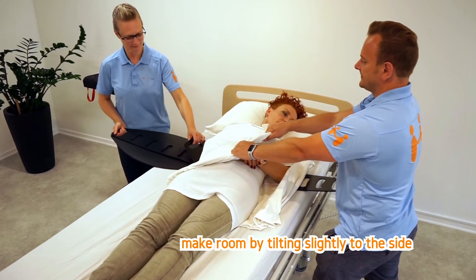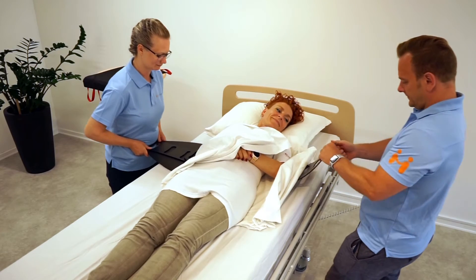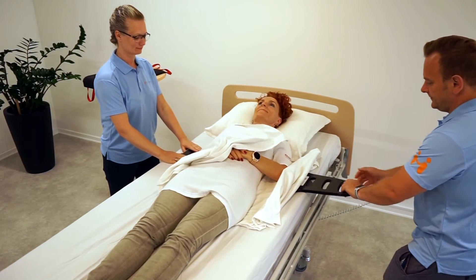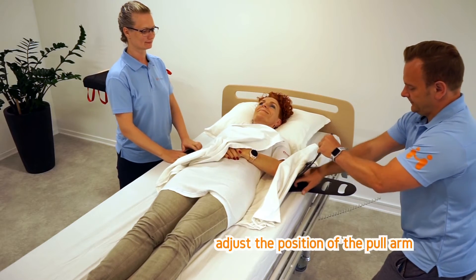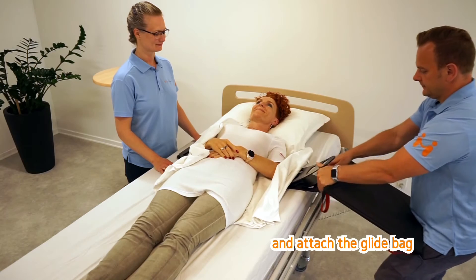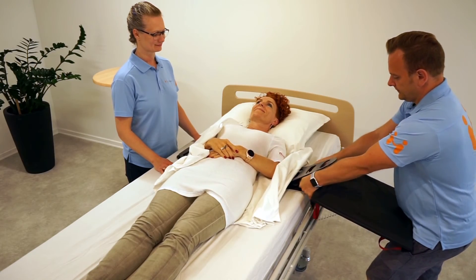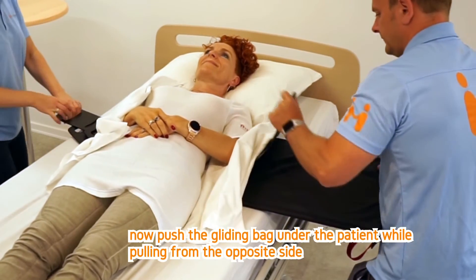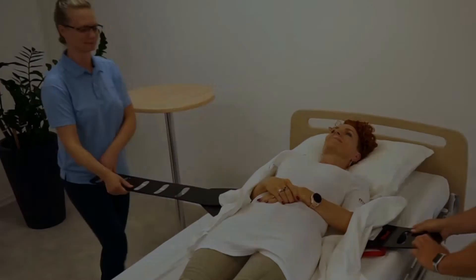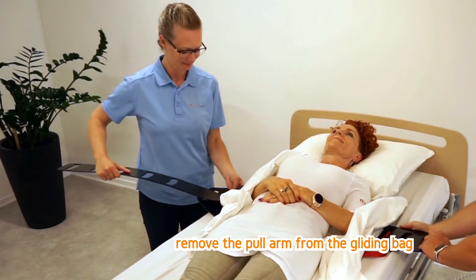Make room by tilting slightly to the side. Adjust the position of the pull arm and attach the gliding bag. Now push the gliding bag under the patient while pulling from the opposite side. Remove the pull arm from the gliding bag.